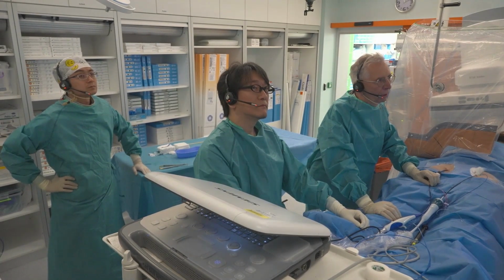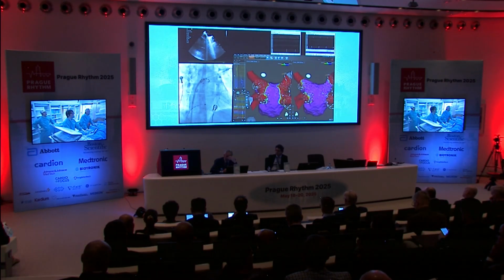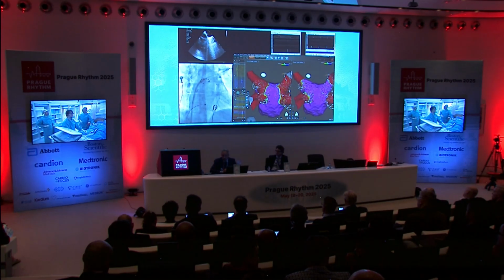If I can add something, yes, please. I share the same experience now. Before, I never chased AFib until it would stop. I did some lesions and then I cardioverted the patient. Today, with Varipulse, I can terminate practically all AFibs which are persistent, or even long persistent with some extensive ablation. Fantastic. But this is not proof that it's really working.